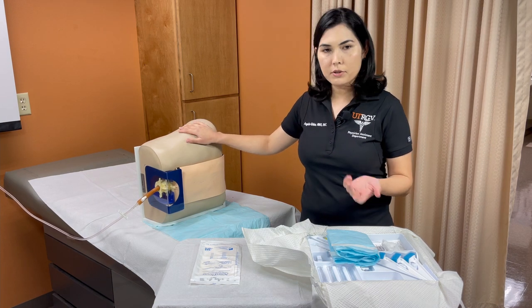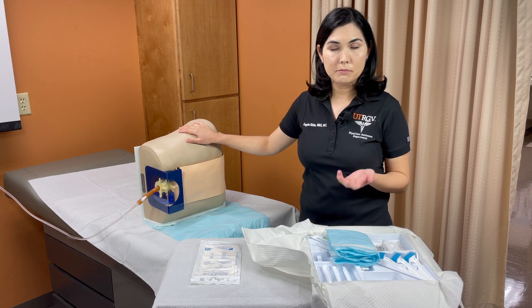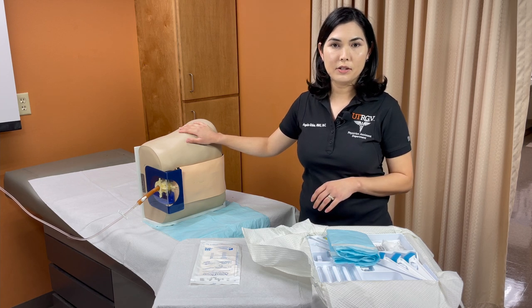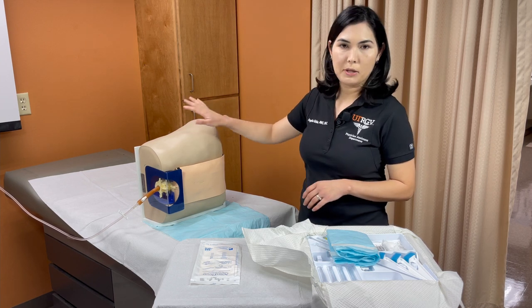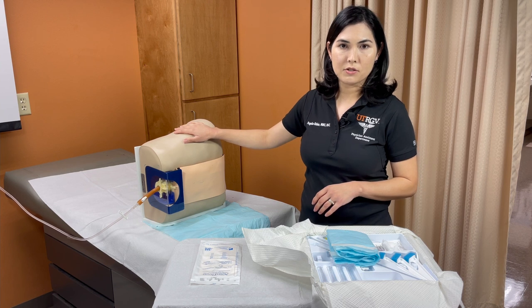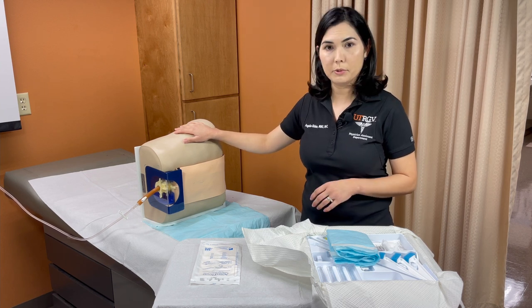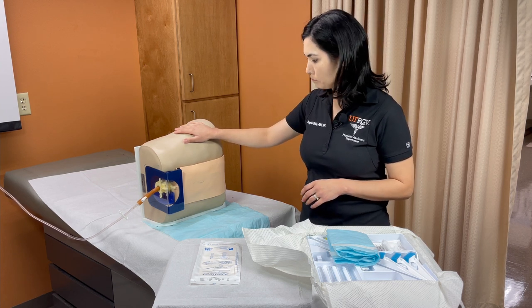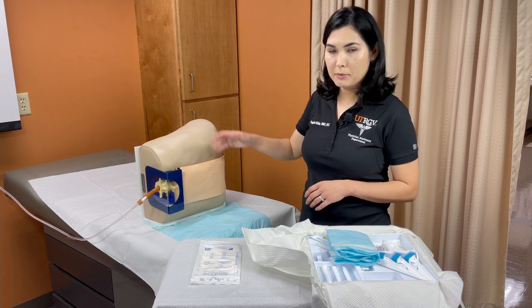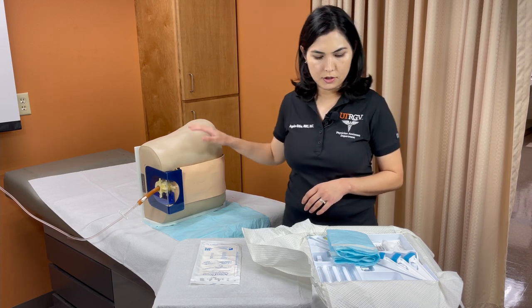This model can be turned to be upright, so you can do the procedure upright or in lateral recumbent position — either way is acceptable. In real life, if you wanted to do manometry and acquire an opening pressure, you would want the patient in lateral recumbent position for an accurate reading. For the demo, the procedure will be performed in lateral recumbent position.